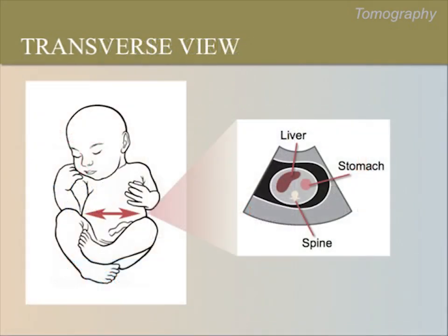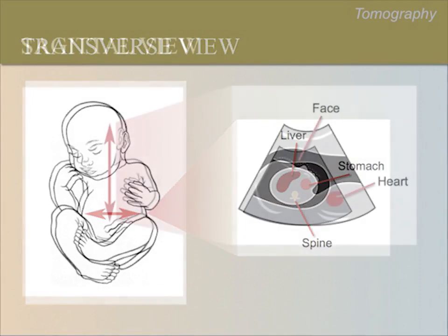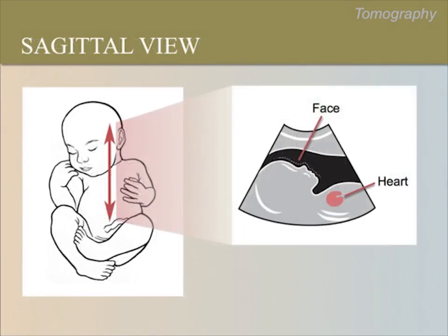This is a transverse view of a fetal abdomen. Imagine that you are at the baby's feet, looking up towards its head through the abdomen — this is how the abdominal area would look from that cross-section slice. This is a sagittal view of a fetus. Imagine that you are looking through the baby from its right side. This is how the baby's profile would look from that longitudinal or sagittal slice.